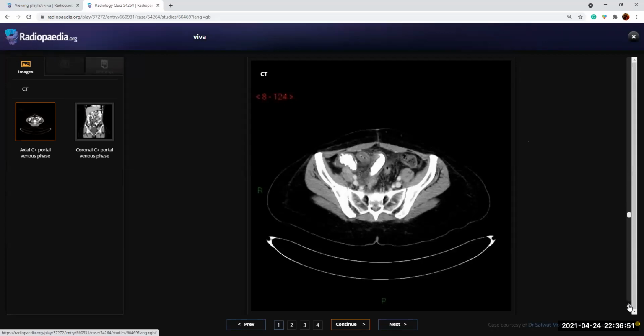Possibly that this patient had some past history of pelvic inflammatory disease, with surgical removal of the uterus and the left tube. You don't remove the uterus for a PID. Sorry? You wouldn't remove the uterus for a PID. Yes. So what else would you remove it for?